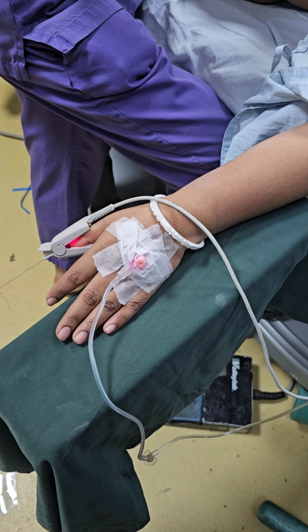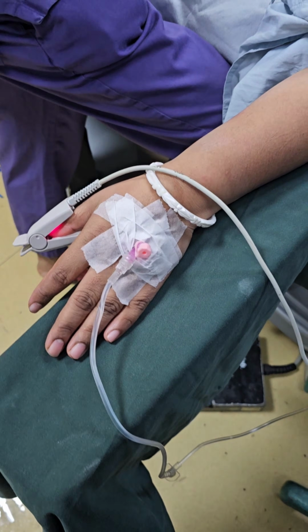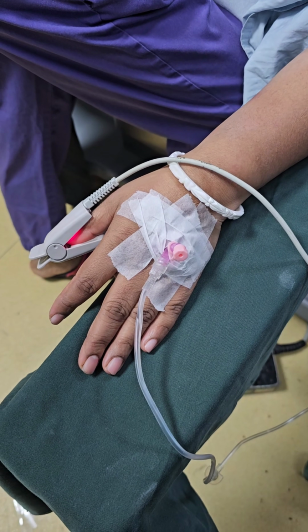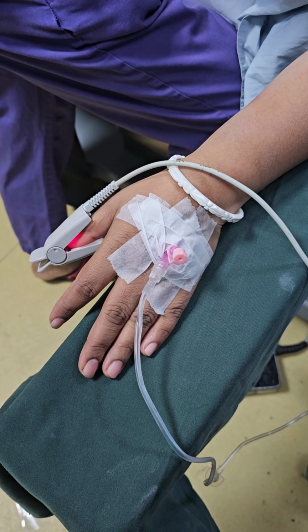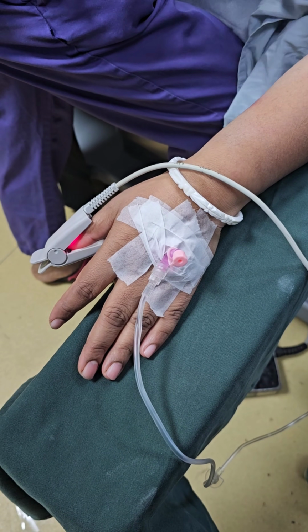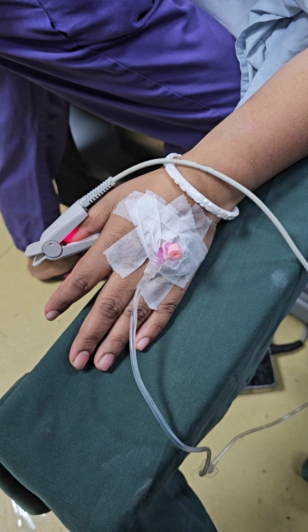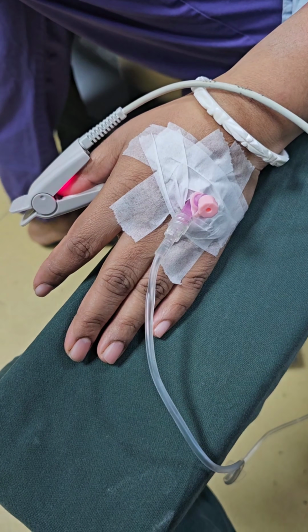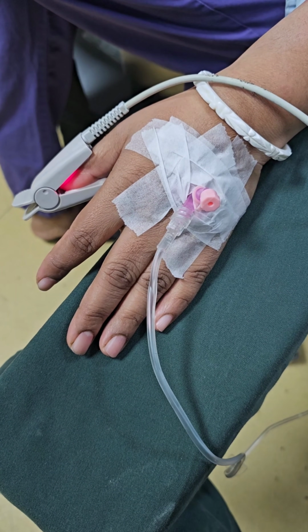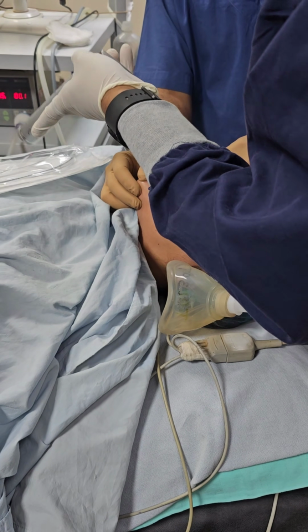We are seeing the channel, and now we are waiting for the fasciculation. The fasciculation has started, but very mildly, and now the fasciculation has stopped. So we are good to go for the intubation, and the intubation process is done.